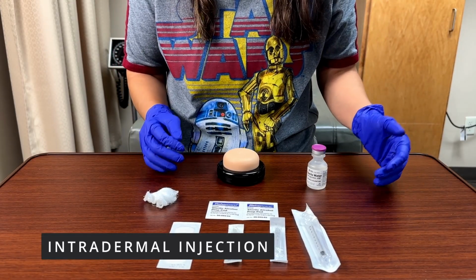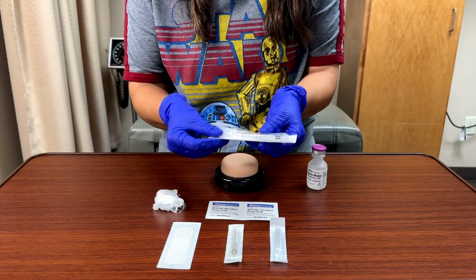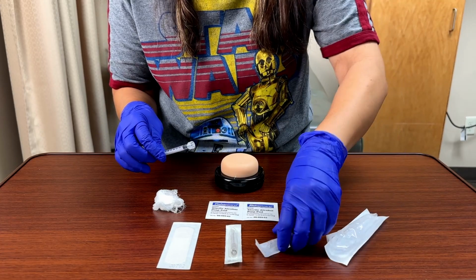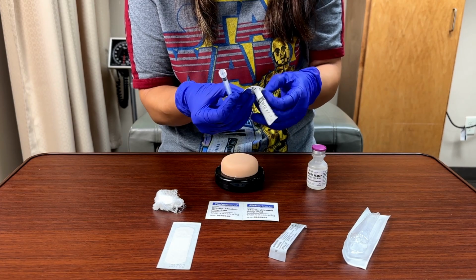This is like what we would do for a TB test, okay? And a lot of us have had that before. So what I'm going to do first is I'm going to get my syringe. All right, and I'm going to take my drawing needle. My drawing needle is going to be my bigger one right here. So I'm going to put my drawing needle on so I can draw up my medication.